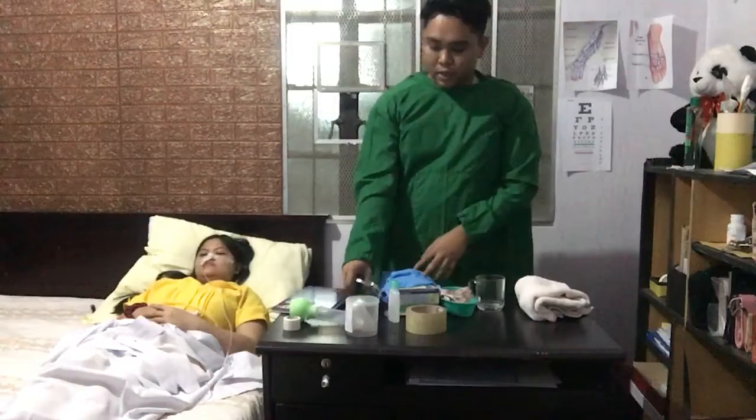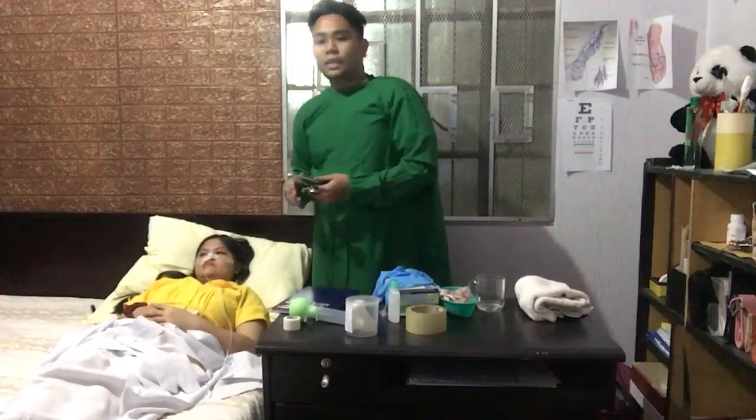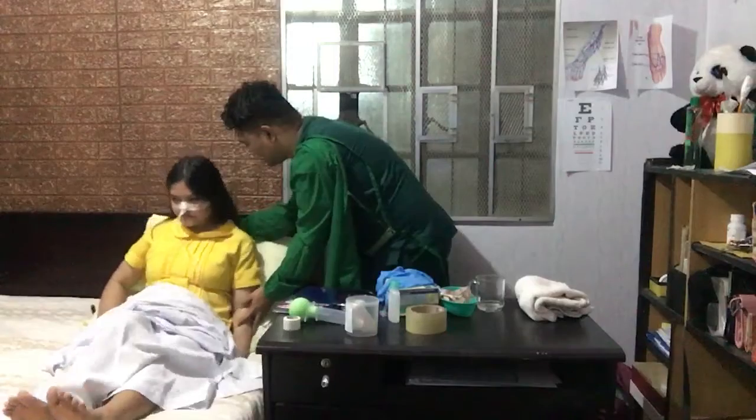Then, perform tayo ng key abdominal assessment, papalpate natin yung abdomen ng patient natin, i-auscultate, and so on. Then, next po nun is position po natin yung patient natin. Especially yung head of the bed is elevated at least po 30 to 45 degrees, as near to normal position for eating as possible. So, it is usually po yung semi-Fowler's position or high Fowler's position. Then, after po nun, so magsusuot po tayo ng gloves.